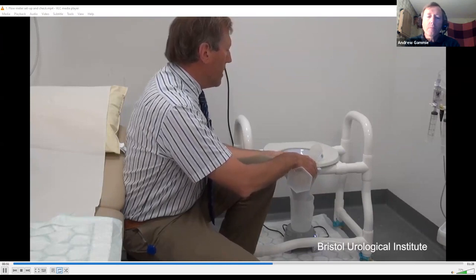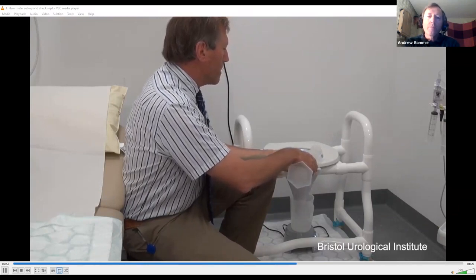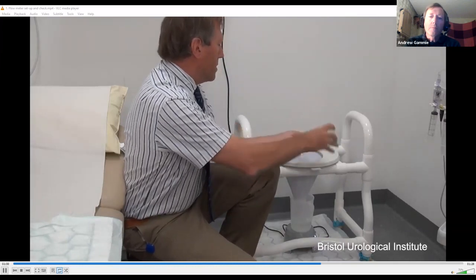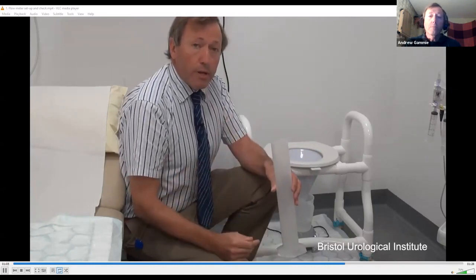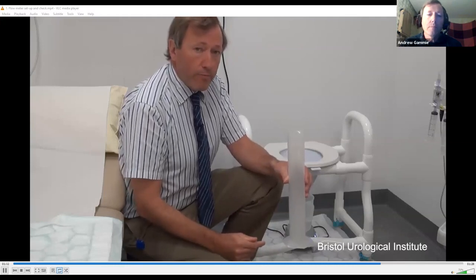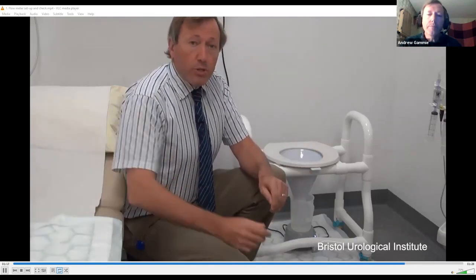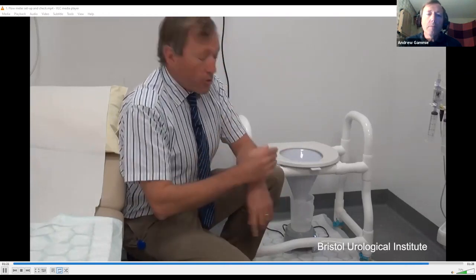I've got 300 mils in this jug, and I'm going to pour it in to the flow meter, pouring it in quite slowly so that it mimics urine flow, and make sure that the whole amount is poured in. I can then check on my screen that actually 300 mils or thereabouts, plus or minus 10 or 15 mils, is registered correctly as the volume. Another way to do this, of course, without the measuring jug, is just to check after the study has been completed that the amount on the screen and the volume that's in the jug match up.